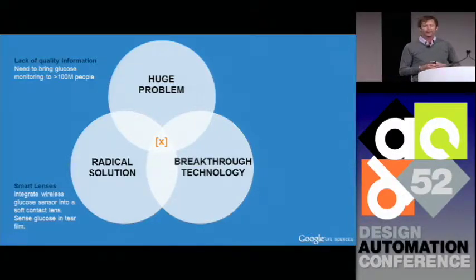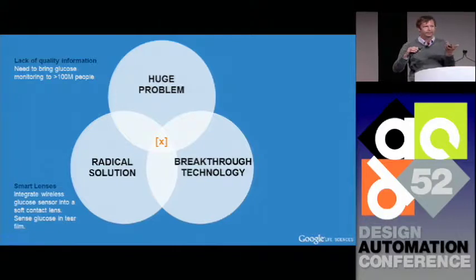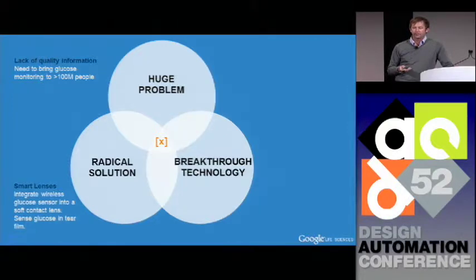But it's tough. We need to be able to take the instrument that's used for measuring glucose from a finger stick or a continuous glucose monitor and somehow shrink it to the size that can fit inside of a standard soft contact lens. If we can do that, then we could have a device that is monitoring glucose levels, not in blood, of course, but in tear film. It's been shown that there is a correlation between the glucose levels in your tears and that in blood.